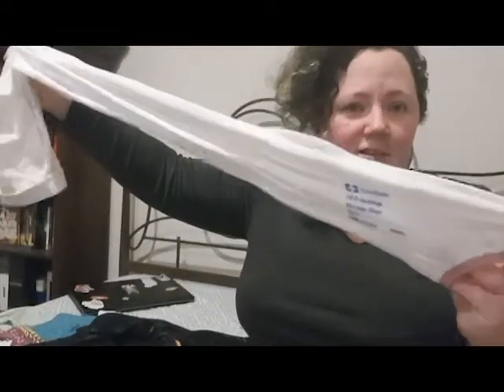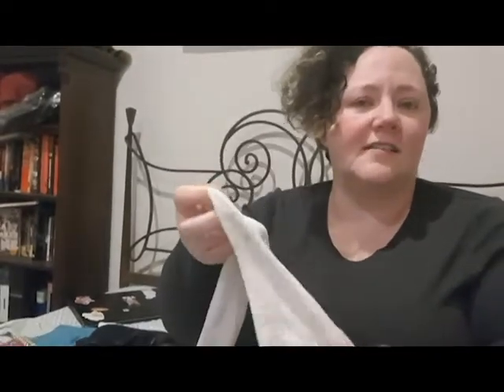There are different types of compression stockings. Some of them will go down to the ankle, and then that cuts in for me, and then of course I get immediate swelling just underneath that. If it goes to below the knee, it cuts in below there and I get extra swelling trapped at the knee joint. If it goes above the knee, so it's thigh high, those ones I find roll down and then get stuck underneath my knee joint, and again cause the same issues. So this is my preferred one, which is why it's a bit more stretched out. It's a bit grubbier simply because that's where I've walked around on it.